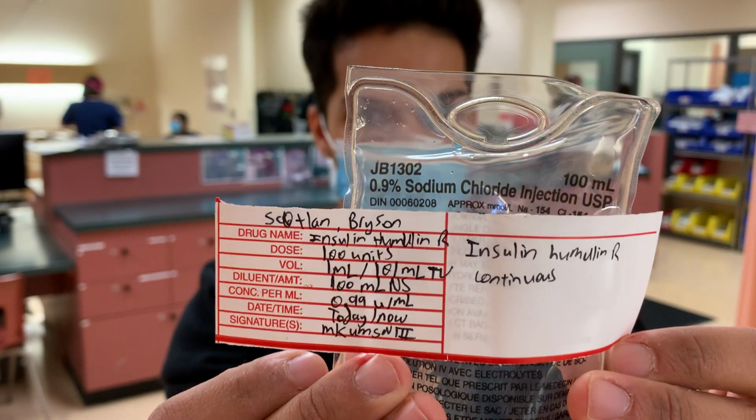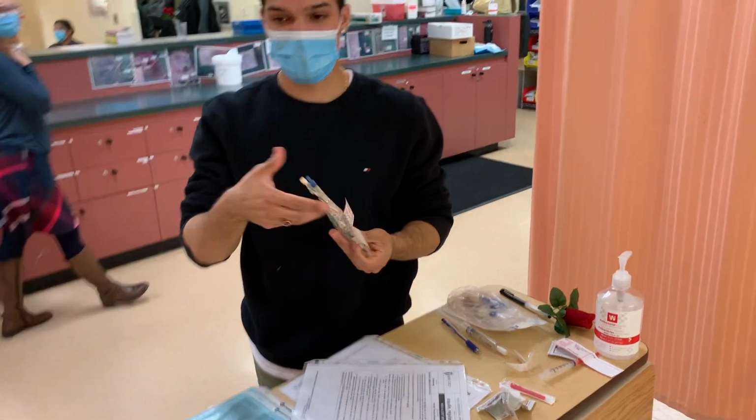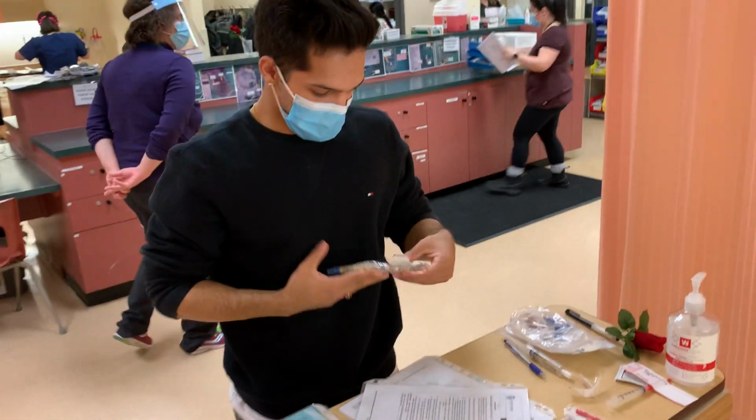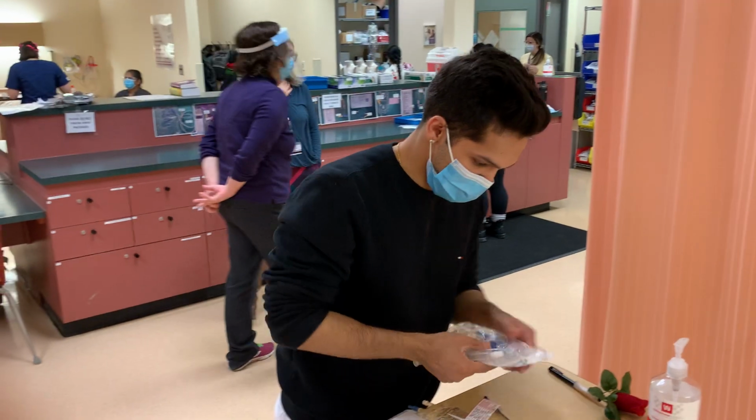So as I head into the patient's room, I'll just be swirling this around just to make sure my medication is fully dispersed within my bag. Okay, now my medication is fully dispersed within my bag. I'm just going to be heading over to the patient's room.